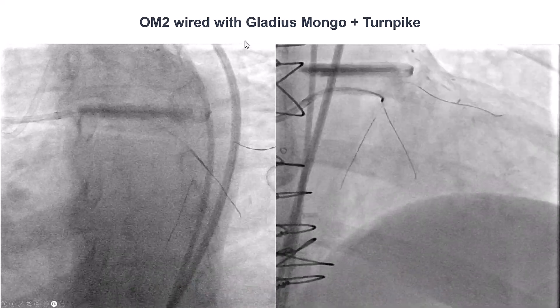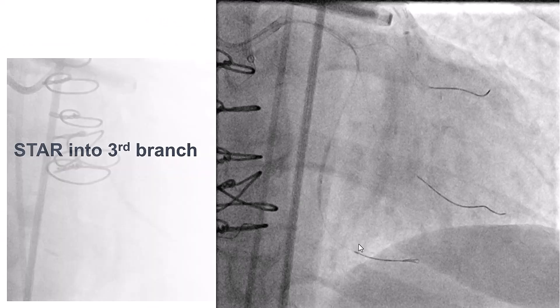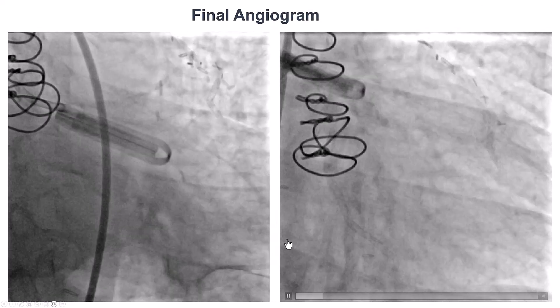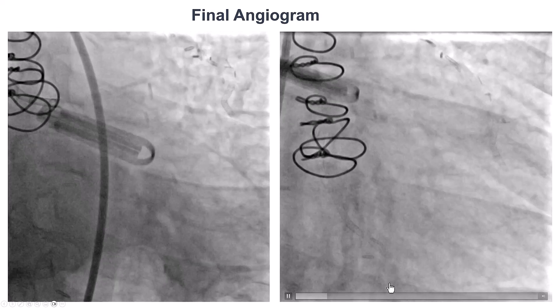We then used the STAR technique to gain entry into the distal true lumen. We used the Gladius Mongo with the Turnpike again for the next obtuse marginal branch, and were able to do the same into the third obtuse marginal branch. We obtained flow and stented into the second obtuse marginal branch, which provided a nice angiographic result, with TIMI flow into the second and third obtuse marginal branches.